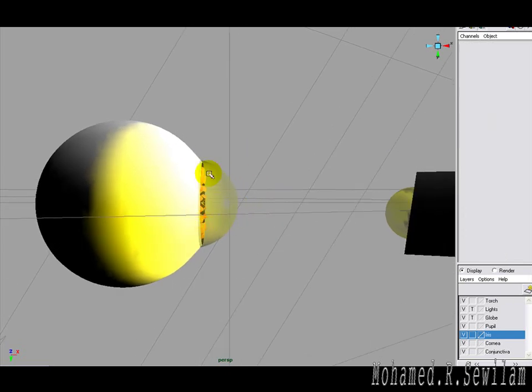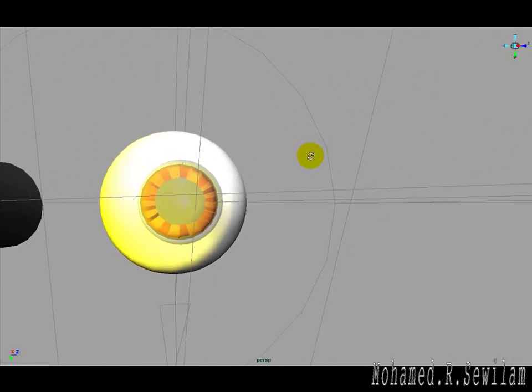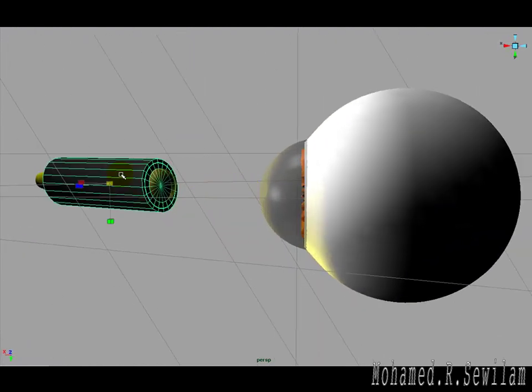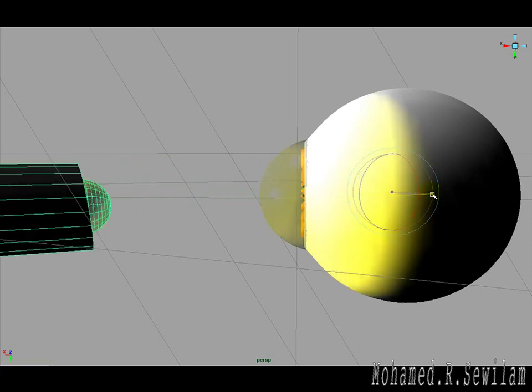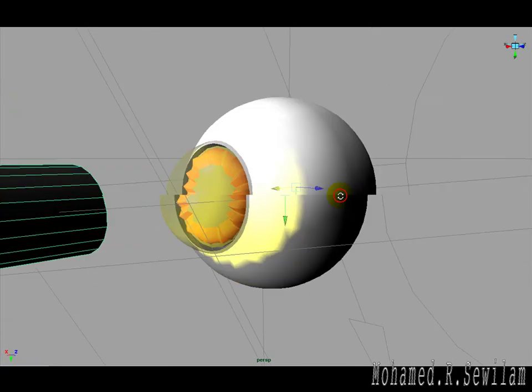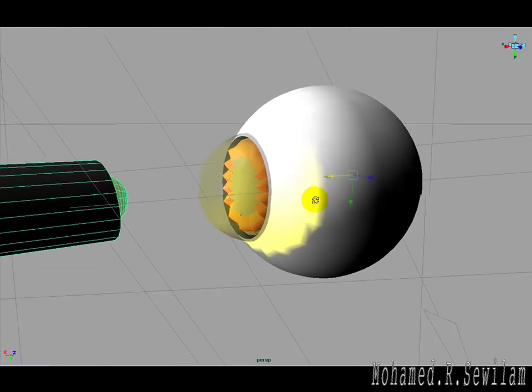So right now we know what causes the deep anterior chamber, and see the depth perception from in front. If I'm looking from in front of the eye, it's wonderful to see it. See too many patients and you can estimate it. If I'm looking from the side of the patient right now, wonderful, the space is so deep. The anterior chamber is all illuminated, the space between the iris and cornea. The anterior chamber is so deep. That's it if I'm looking from in front.